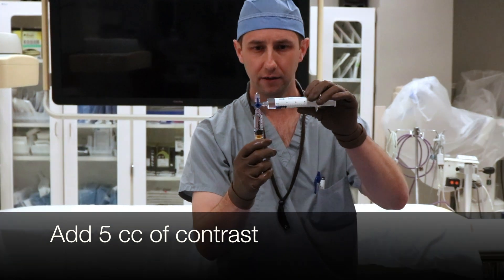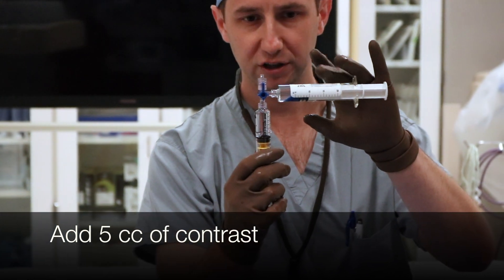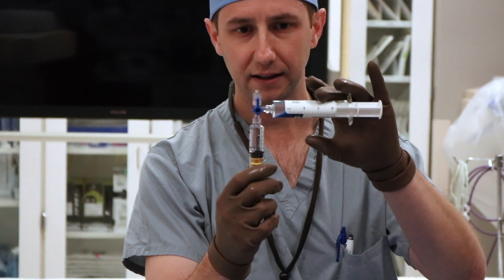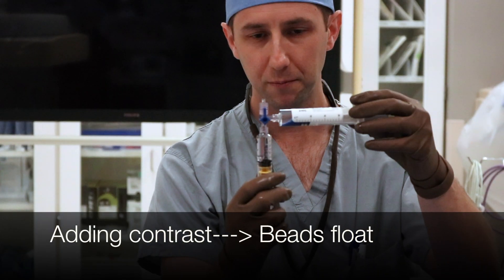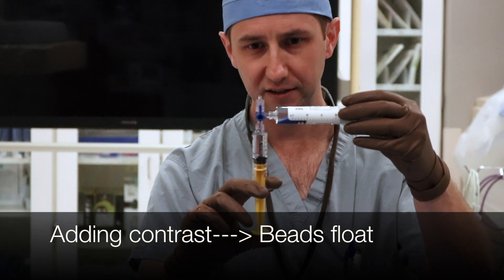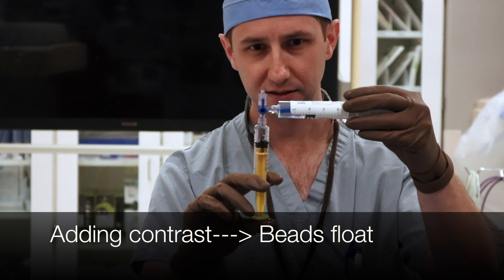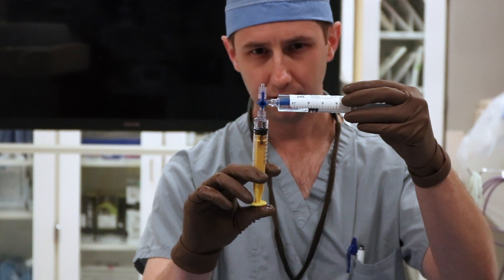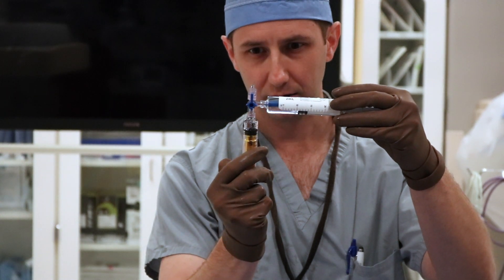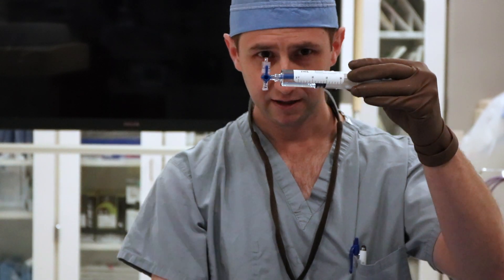Then take five or six cc's of contrast. As you can see right now, with the beads they're all going to layer in the very dependent portion of the solution. The more saline you add, the more the beads will sink; the more contrast you add, the more the beads are going to float. We're going to try and get these things to hold right in the middle of the suspension, so we're adding some contrast. We've added about five cc's of contrast and as you can see that's making the beads float.